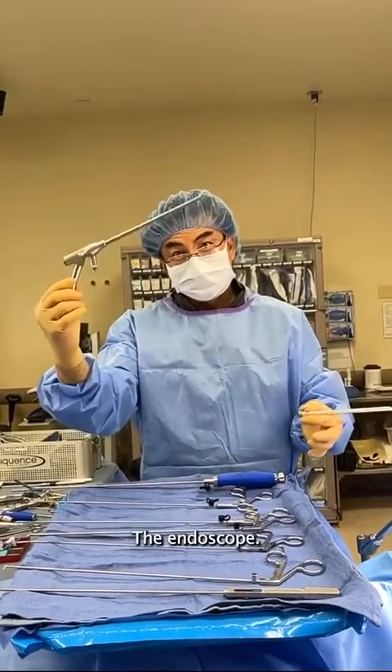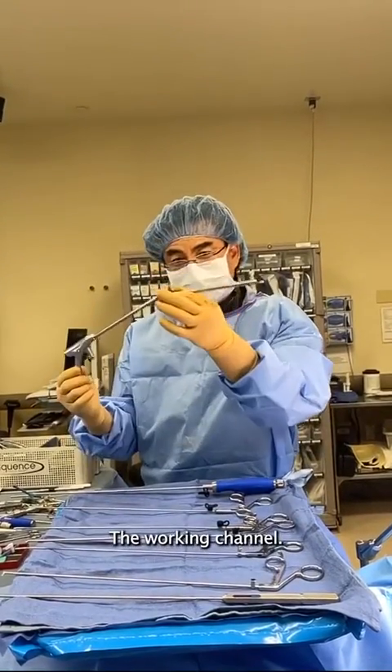Here are the key endoscopic instruments. The endoscope — that's kind of key. The working channel — that's kind of key.